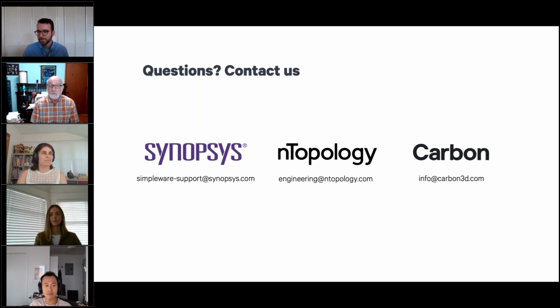There are a lot of great regulatory and quality control questions around that. But if we can get past those, bringing the whole process from collecting the data to creating the digital construct to printing to bringing it to the patient all at the same site is huge.